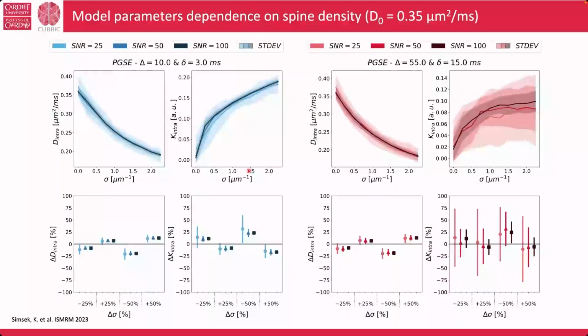And here we have done some analysis to show how sensitive you are to changes in spine density, because some pathologies or conditions lead to an increase or decrease of spine densities. And so it seems once again, with the preclinical scanner, we are already there. With clinical, you need to have a very, very high SNR. So it's still a bit challenging. But again, Connectome scanner, SIMA-X, they will go into this blue regime. So really exciting years to come where we can really apply this to humans.